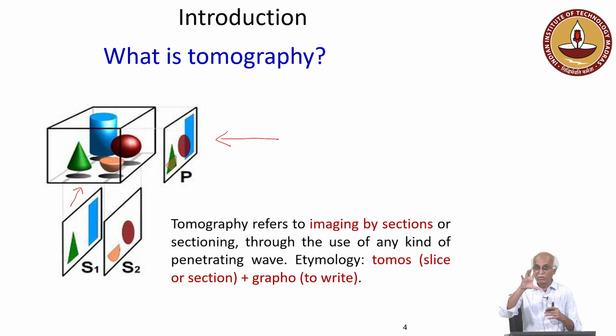Of course, the object which is seen clearly may be in the front, but the object lying in the back will also be seen if its size is bigger than the size of the front object. If part of it is clearly seen, then we know the object is also there at the back side of the front object. However, at what position, etc., we will not know.